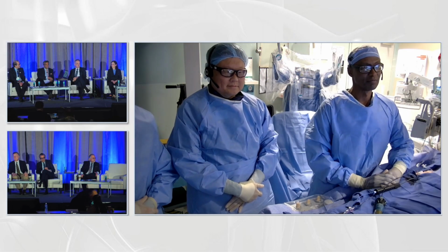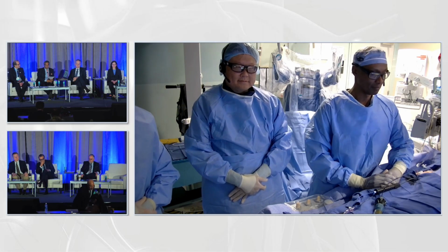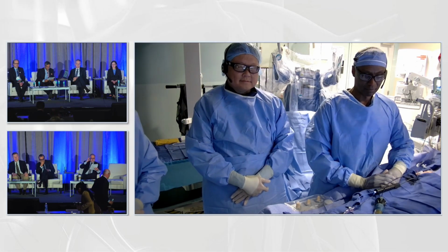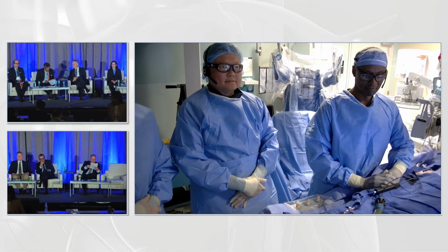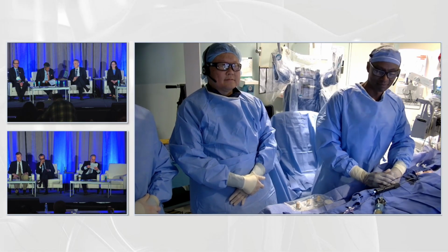So we're going to go ahead and get started, and I think we can go ahead and get started with a live case. This is a live case of PVI isolation using the Variable Loop Catheter, the Variable Catheter.